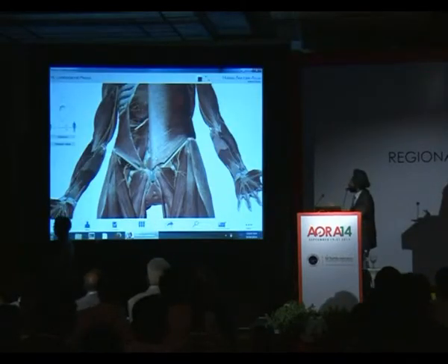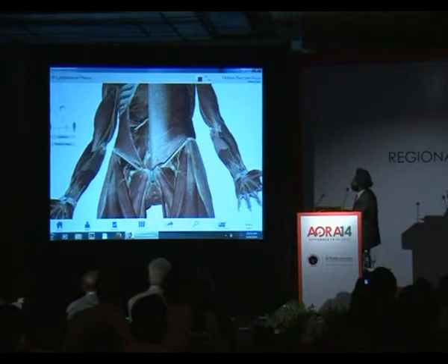First of all, how is this hourglass formed? So this is again the right side, anterior superior iliac spine, pubic tubercle. A probe is kept somewhere here. So you see the sartorius muscle starting from here, going medially. And if we have a look here, it is tapering here. So that is forming the caudal part of the hourglass.